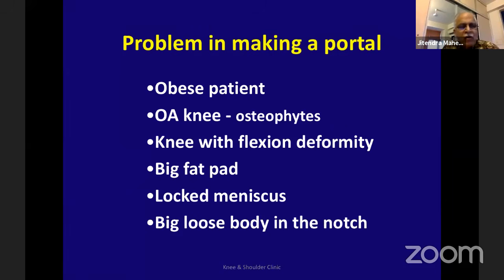And once you know on the X-ray that there's a loose body there, and you know it is going to be a little bit of a tussle to enter the joint, but I know the reason and I will handle it. So once you know all these things, your performance increases. It's a patience game. If there's anything on which you can lose your patience, your performance goes down, and all the arthroscopy equipment trolley starts laughing at you because they can see you struggling.